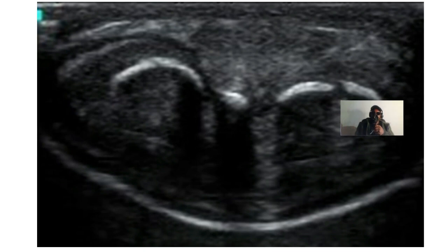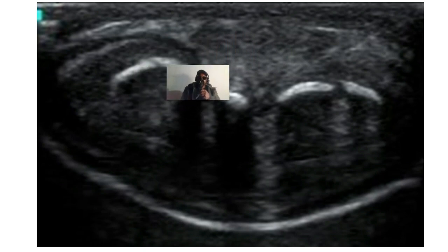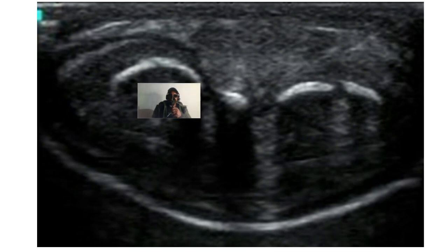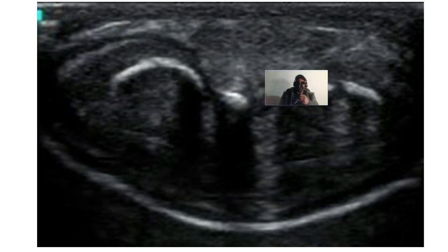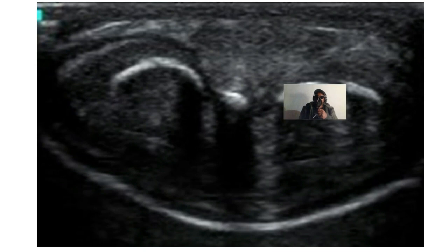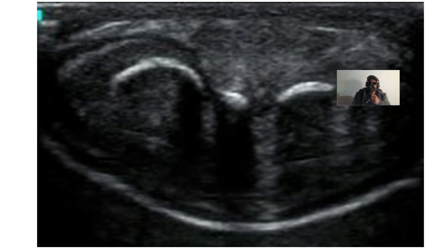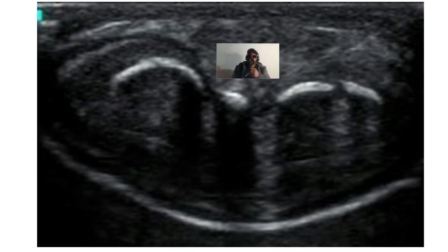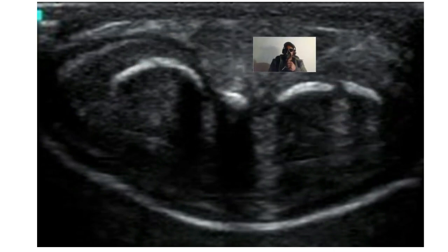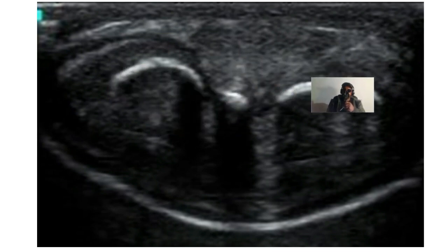So you know that the muscle of the penis doesn't have bone, it doesn't have calcifications. So when calcifications like these ones start to form, this transformation is in keeping with a condition that we refer to as Peyronie's disease. So you're just doing your ultrasound scan, and then you come across these calcifications, you have made a diagnosis of Peyronie's disease.